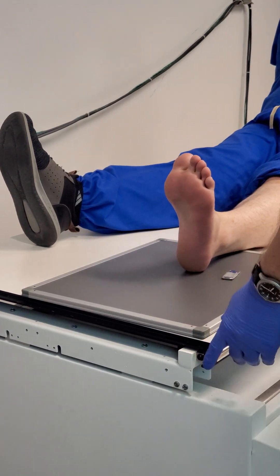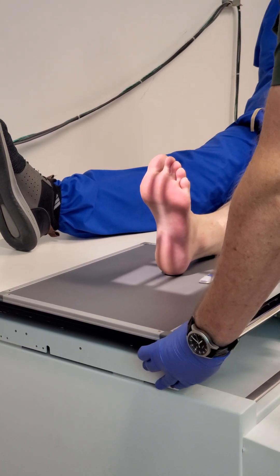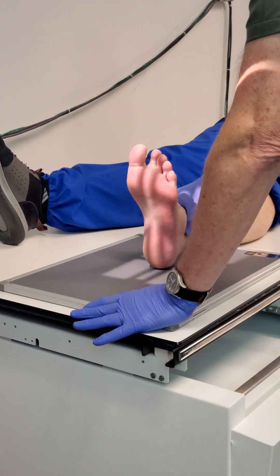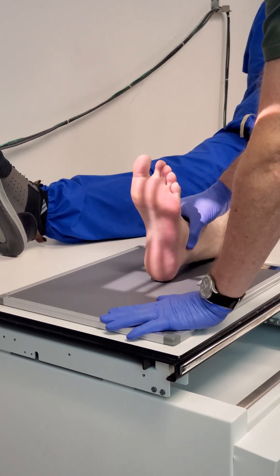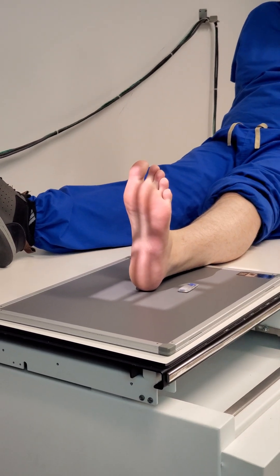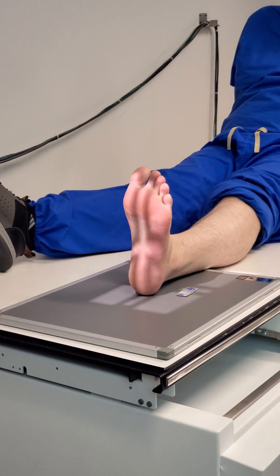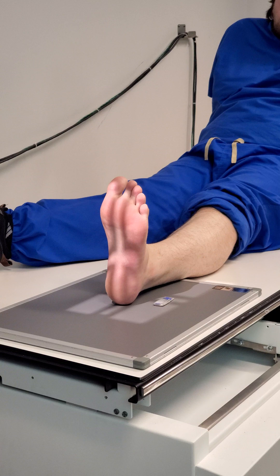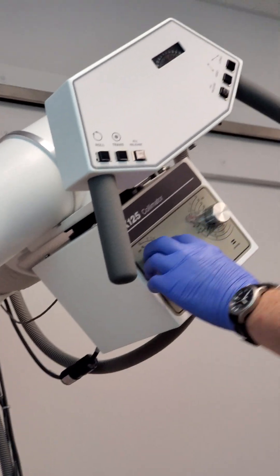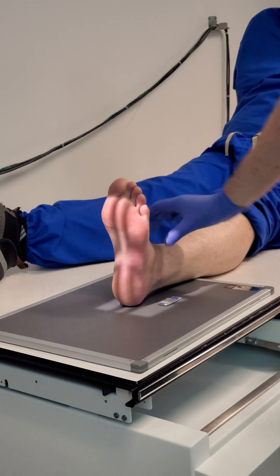Central ray is going to be at the base of the third metatarsal — right about there. I'm going to try to have our image centered on the image receptor. If the patient cannot dorsiflex to 90 degrees, you're going to need to increase your angle slightly. Which joint do we need to see open on this projection? The calcaneal-cuboidal joint. Put your marker on the lateral side as always.